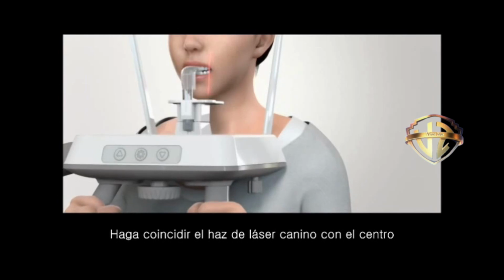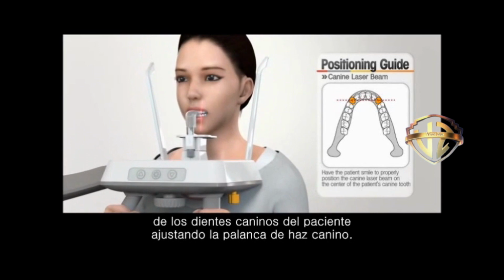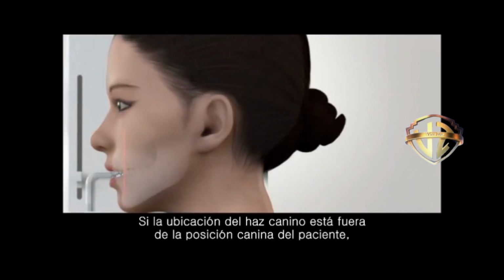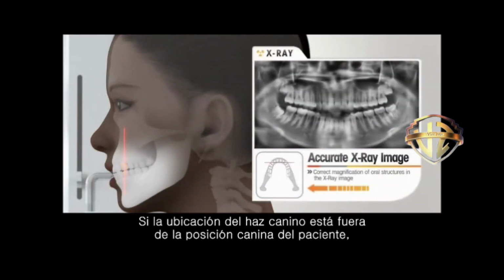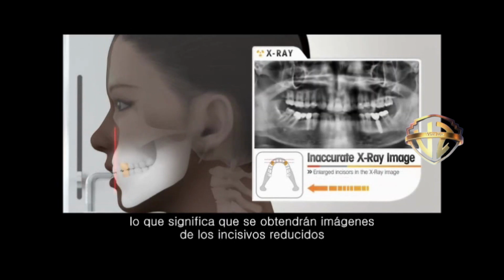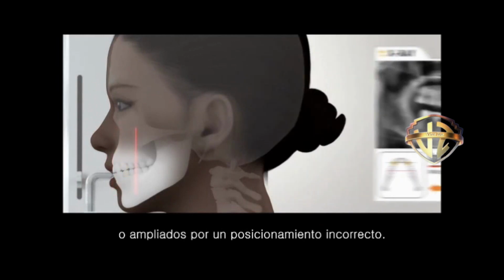Match the canine laser beam at the center of the patient's canine teeth, adjusting the canine beam lever. If the location of canine beam is off the patient's canine position, incisor image can be incorrectly magnified, which means reduced or enlarged incisor images are achieved by incorrect capture layer.